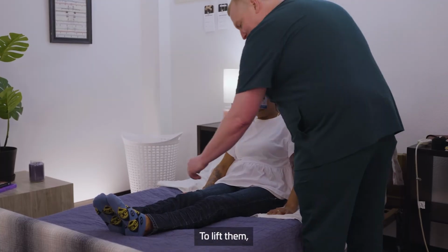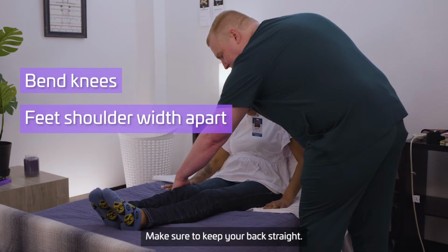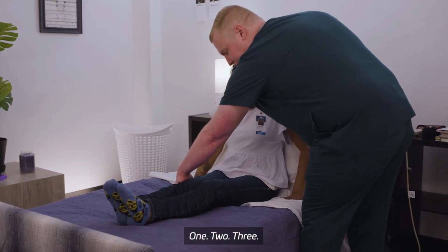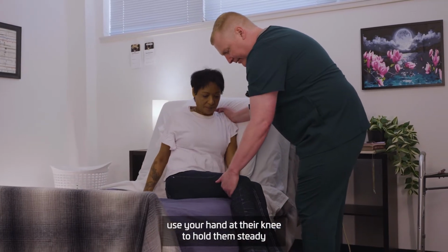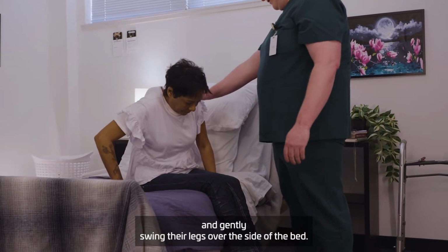To lift them, bend your knees and position your feet shoulder width apart. Make sure to keep your back straight. Rock back and forth as you count aloud 1 to 3. 1, 2, 3. As you lift them from beneath their shoulder, use your hand at their knee to hold them steady and gently swing their legs over the side of the bed.